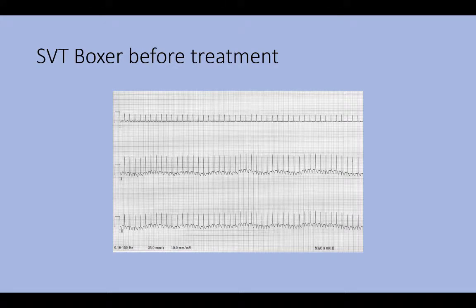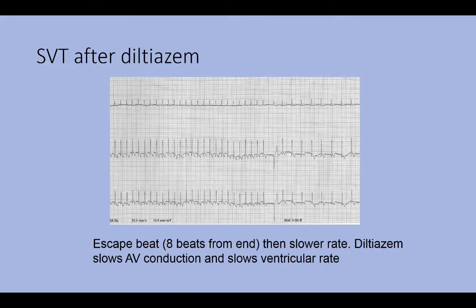This is an ECG from supraventricular tachycardia in a boxer before treatment. Lead 2 is in the center, and you can see an upright and narrow QRS, a very rapid rhythm, and no visible P waves. If you look at the R-to-R interval, you would see that it is irregularly irregular. After giving diltiazem, the rate slowed enough that we got an escape beat — a wide, bizarre complex coming from the ventricle — and then we have a supraventricular tachycardia at a much slower rate. So diltiazem is slowing conduction through the AV node and slowing the rate enough to improve perfusion.